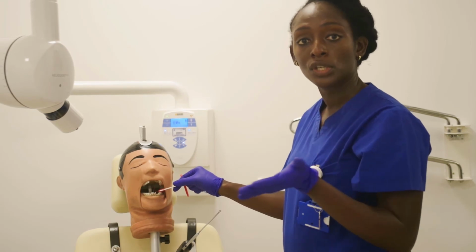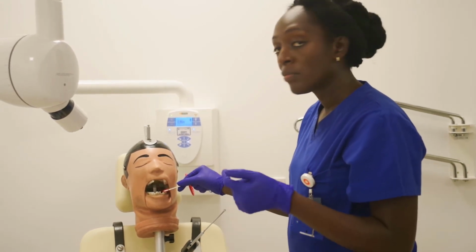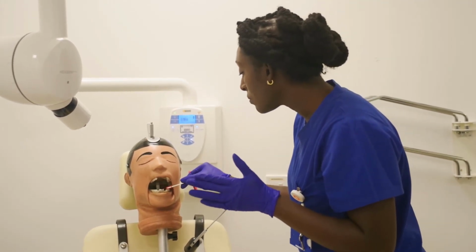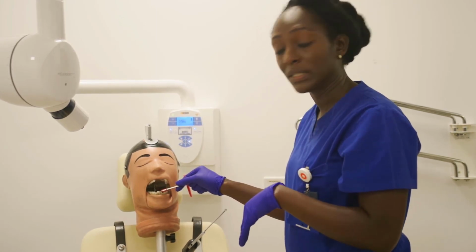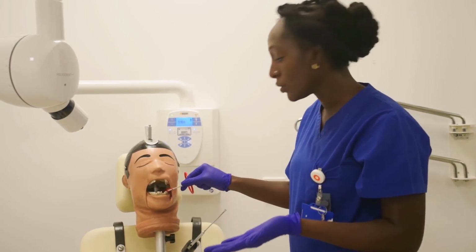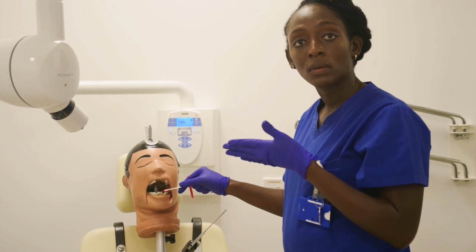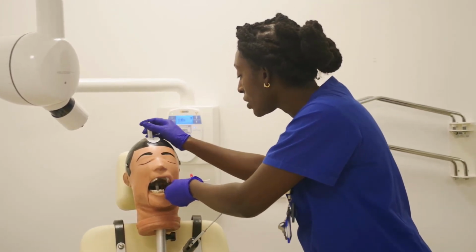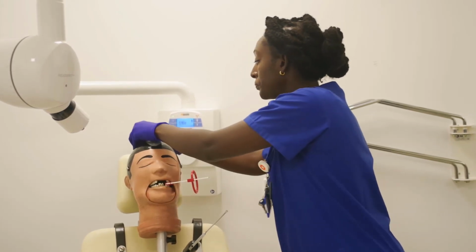So same positioning as you would for anterior and posterior teeth. But then remember that the edge of the phosphor should be sort of middle of the 3 to guarantee that you get the premolars in. So I don't want to push it too far back, otherwise I'll miss the premolars, or neither do I want it too far forwards because I wouldn't get it parallel to the long axis. So there, about 3 region, get the patient to gently back down.